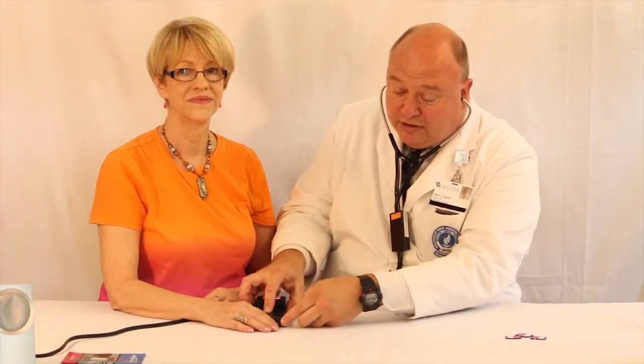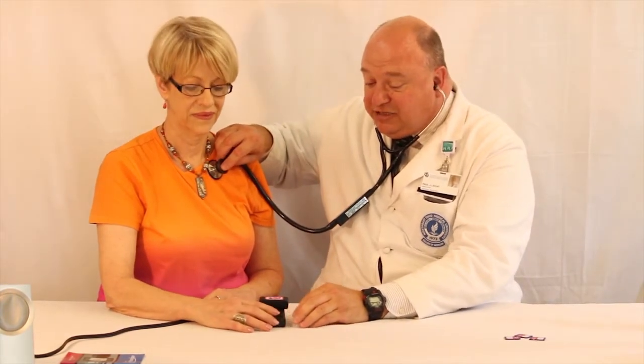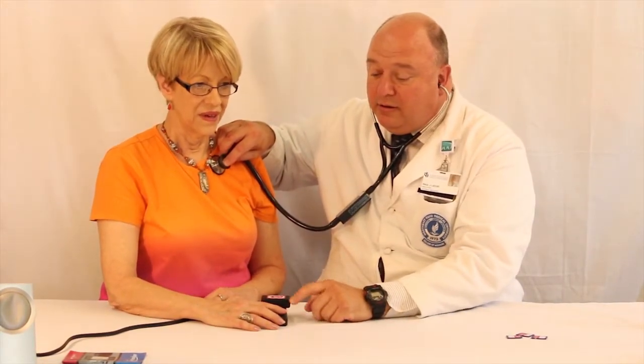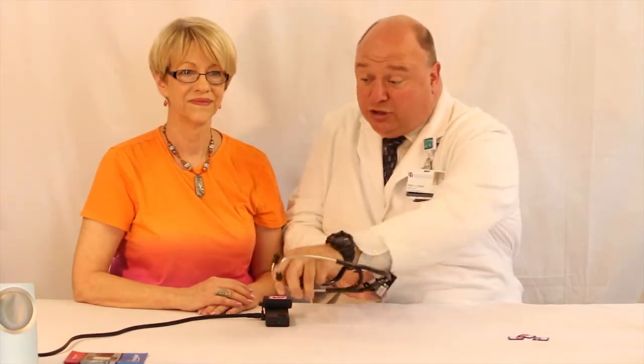Now on the plug-and-play cards, these are designed to be able to run right out of the box. We've also included the blood pressure sounds and the lung sounds. We'll ask the patient to take a deep breath in and out. All of this is already on the card, so you don't have to spend time transferring sounds onto different SD cards.